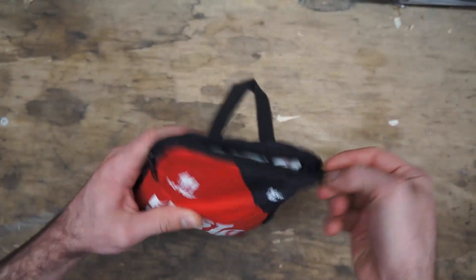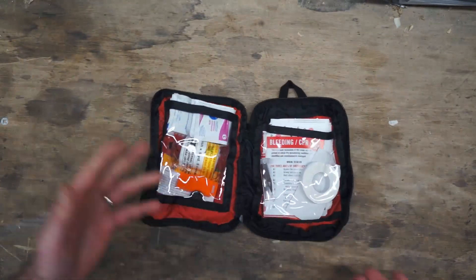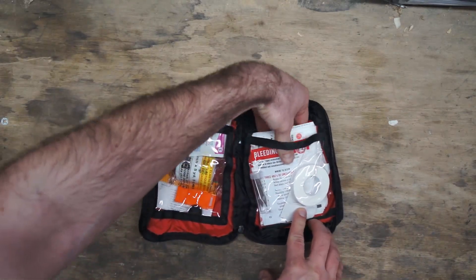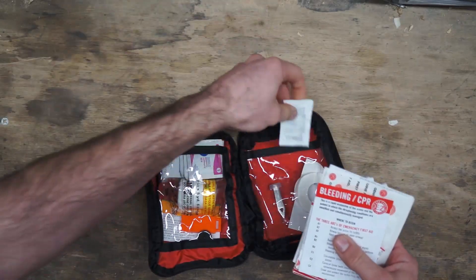I want to go through this, show you what's in it, see if it's actually good enough for what you want it for, and give some ideas of what you can really use it for. Starting on the right-hand side, there's a pretty large pile of stuff in here.